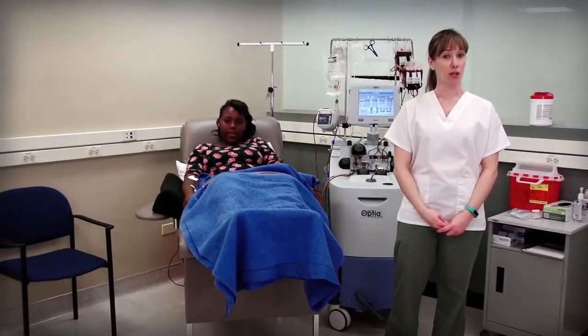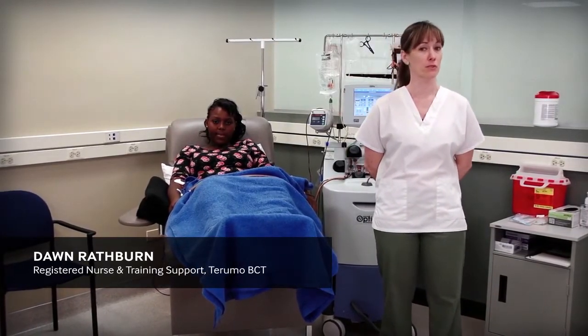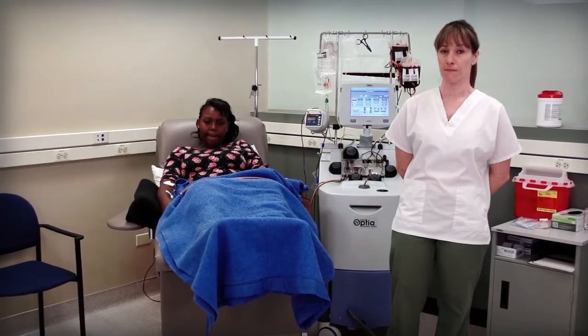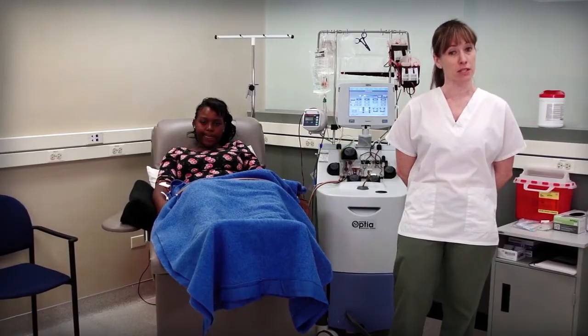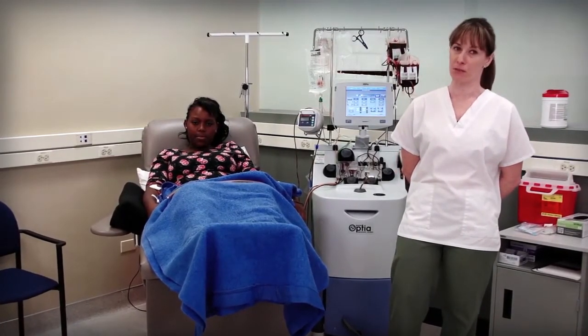If you or someone you know has sickle cell disease, this educational video can help you better understand red blood cell exchange, a medical procedure used for the transfusion management of sickle cell disease. The red blood cell exchange procedure removes the patient's red blood cells and replaces them with healthy red blood cells.